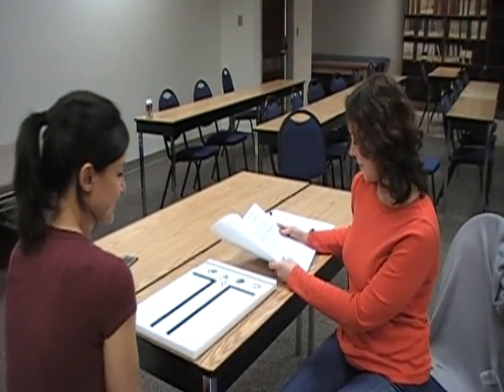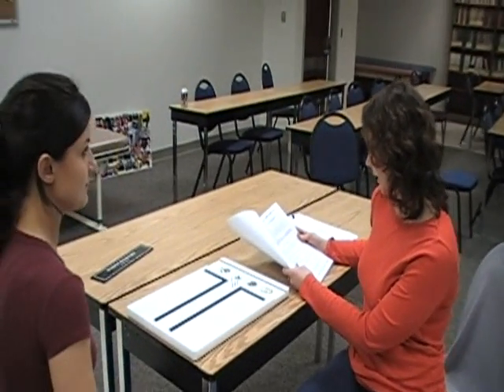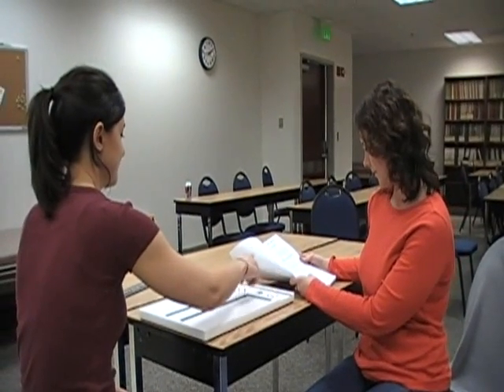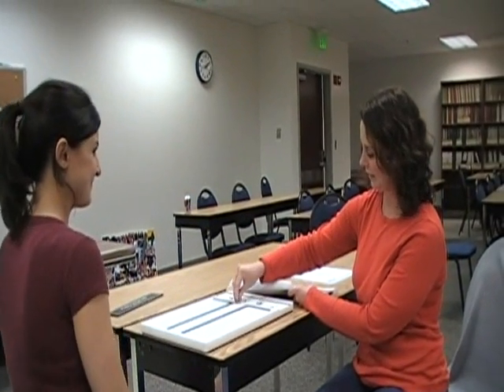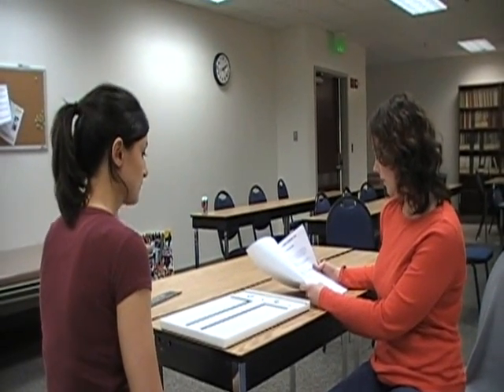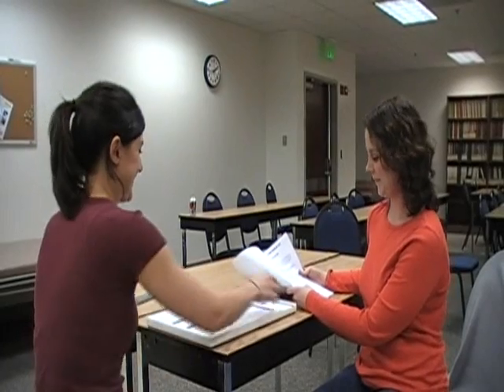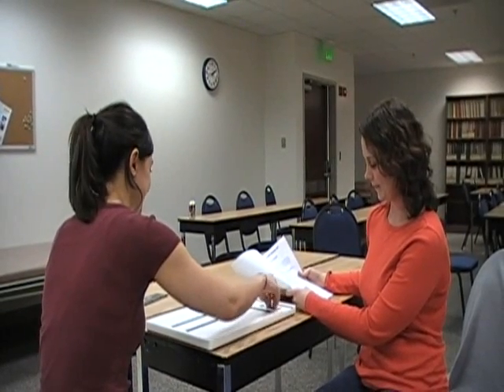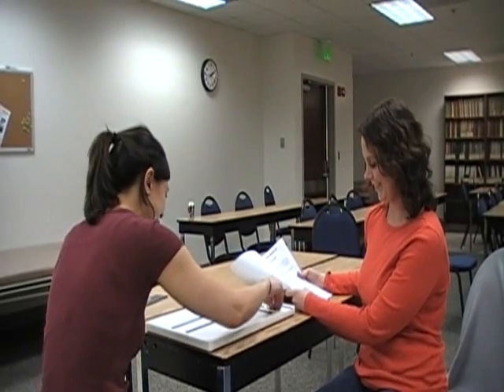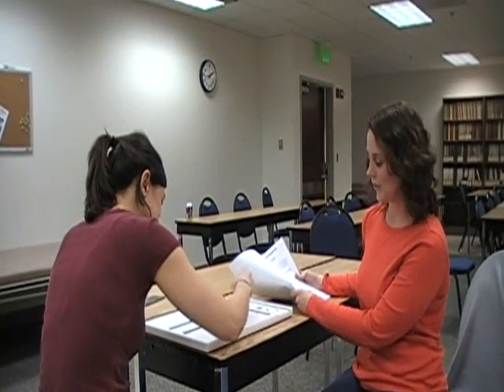Say 'Okay, stop. Now take out the practice pins and put them back into the right-handed cup.' Then say: 'When I say begin, place as many pins as possible in the right-handed row, starting with the top hole. Work as rapidly as you can until I say stop. Are you ready? Begin.' Allow them to continue for 30 seconds.